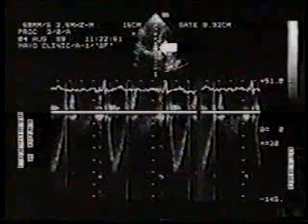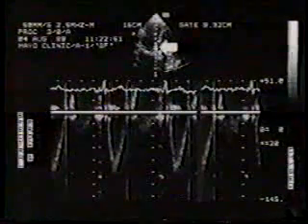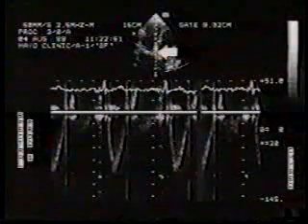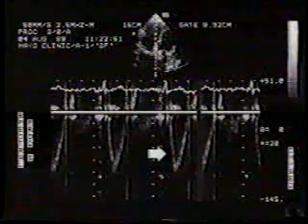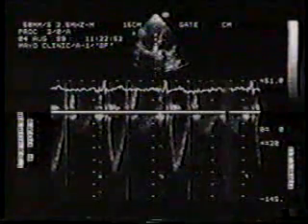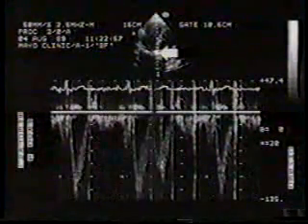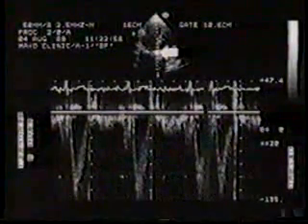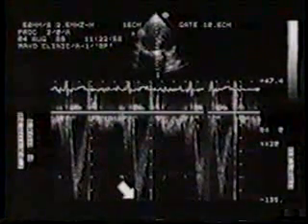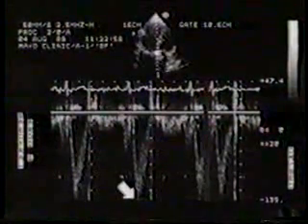This sample volume position, just below the aortic prosthesis, is the one we want to use to obtain the LVOT velocity. As previously discussed, if we advance the sample volume too far toward the sewing ring of the prosthesis, the LVOT velocity will show a sudden, marked increase, as we will now illustrate. With this sample volume position, the LVOT velocity has increased to 1.35 meters per second. Using this value in the continuity equation would yield a falsely large effective orifice area.